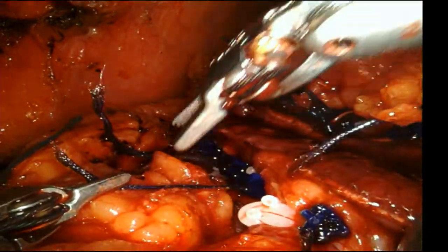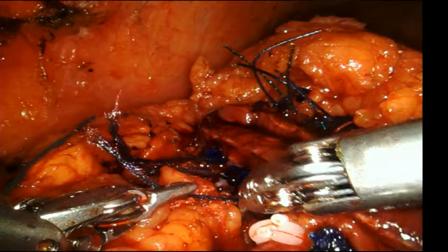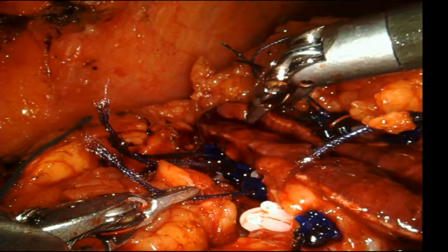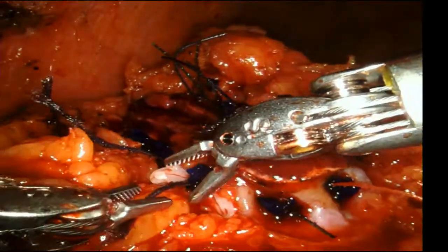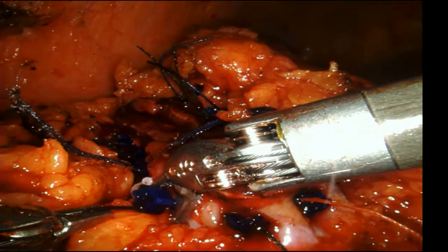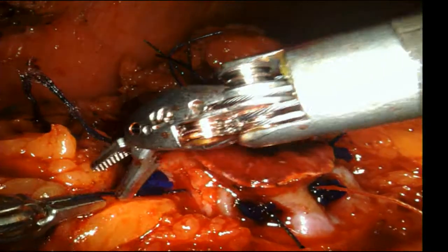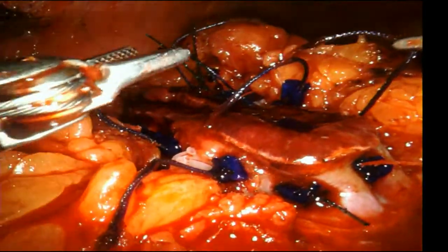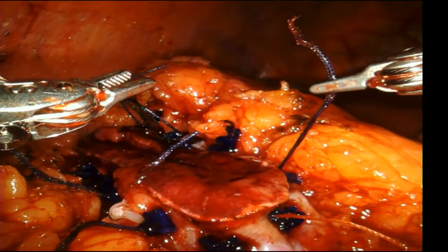I'm not being wimpy on the cranking, because I know it's not going to tear out. It's deep to the entire defect. If I was just grabbing the two edges, there's a pressure at which I could crank on it that it would just tear out. But here I can crank on it and get super-physiologic pressures, so that, again, I don't have to worry about bleeding. And if I missed a little collecting system defect or something, you know, that one is sliding too. Put another one on here. So basically, I'm sleeping well at night when I do partials.